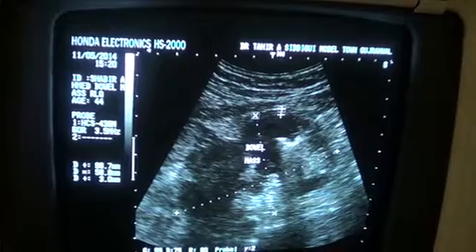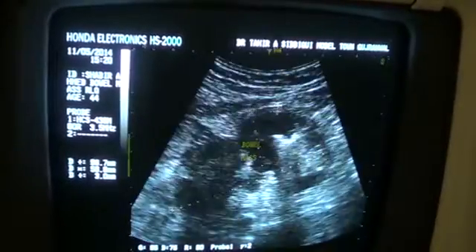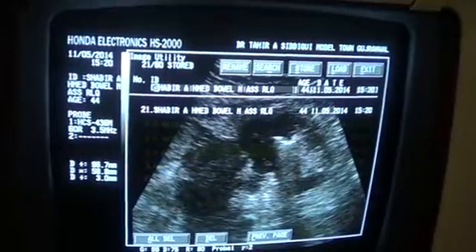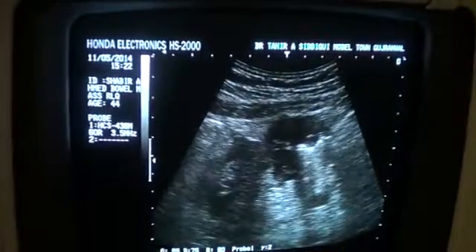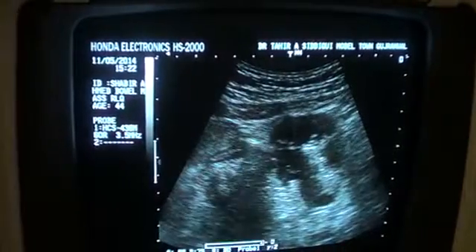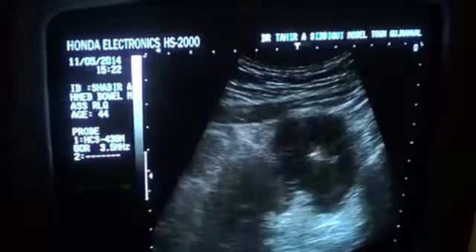So it's most probably an ileocecal mass. These echogenic areas you are seeing within this bowel segment, along with a few septations with a fluid compartment.